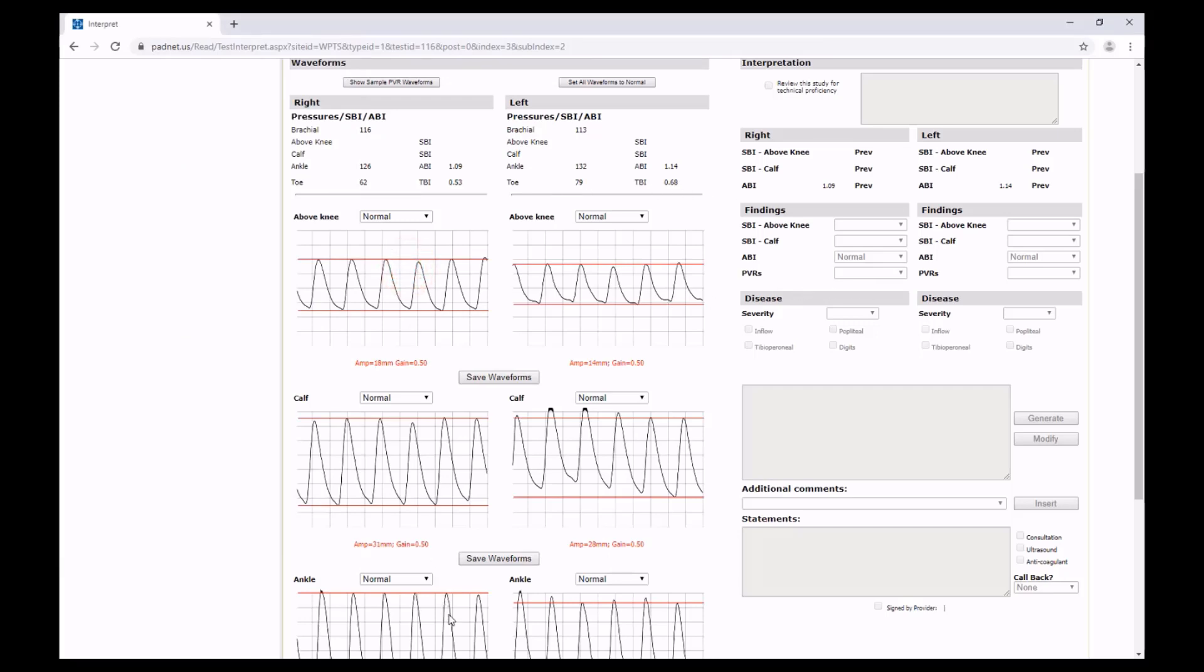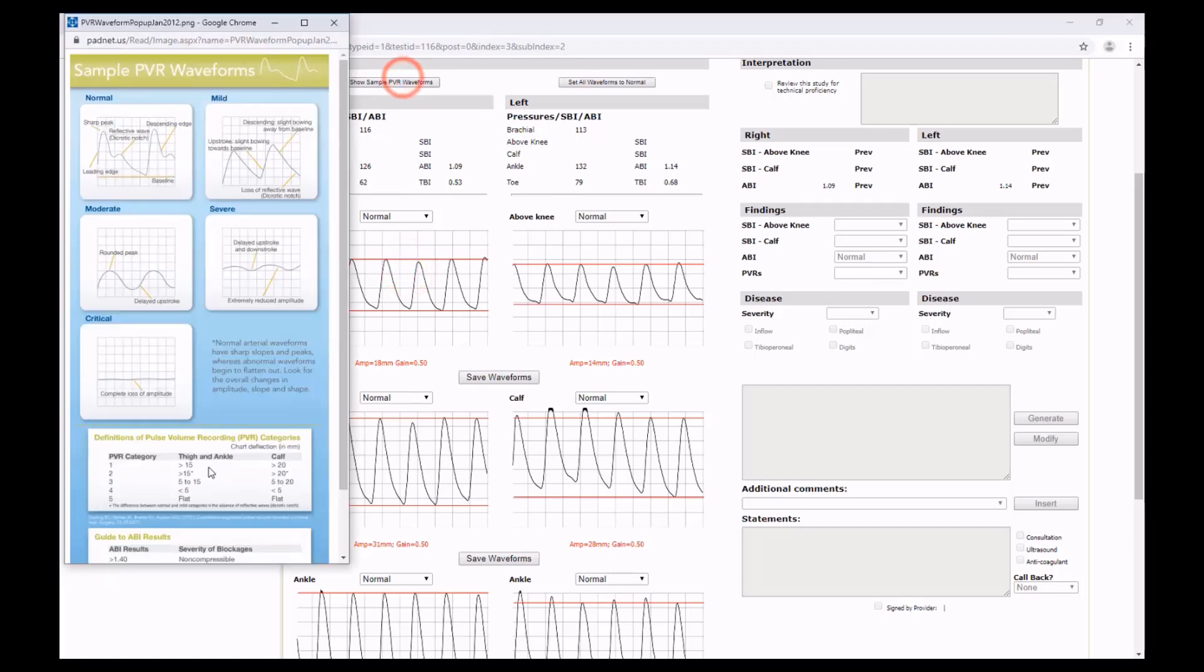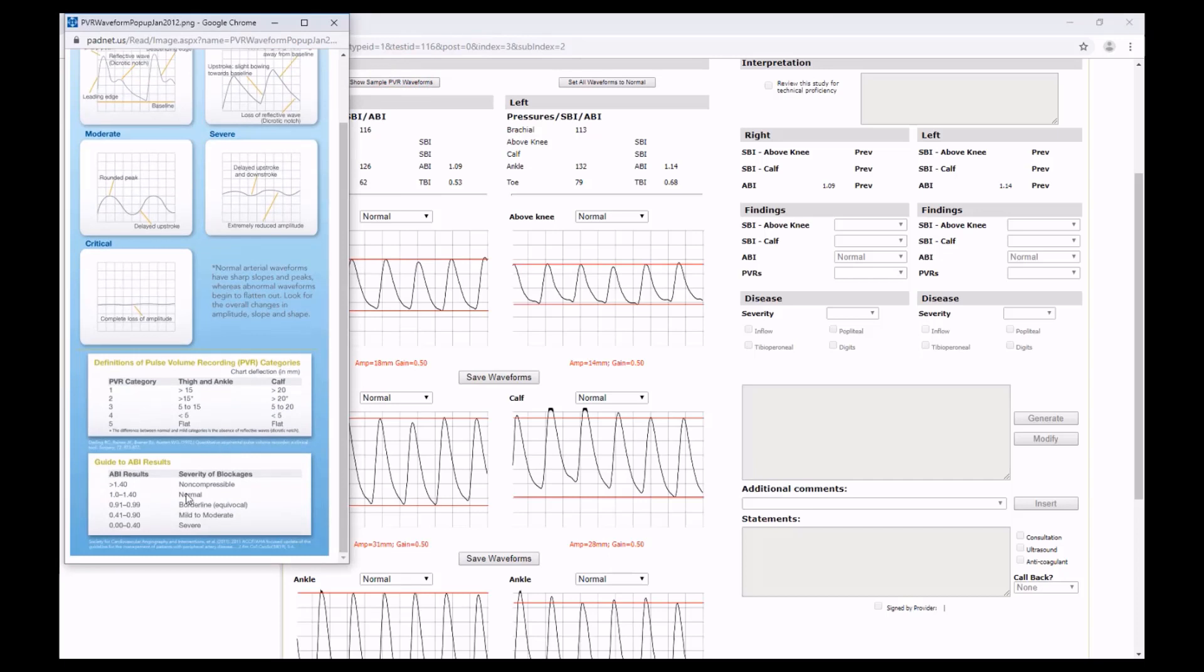Now with our ABIs, you'll also notice it's at the bottom of this image right here. The ABI is automatically calculated, and you can directly compare those numbers to this metric right here.